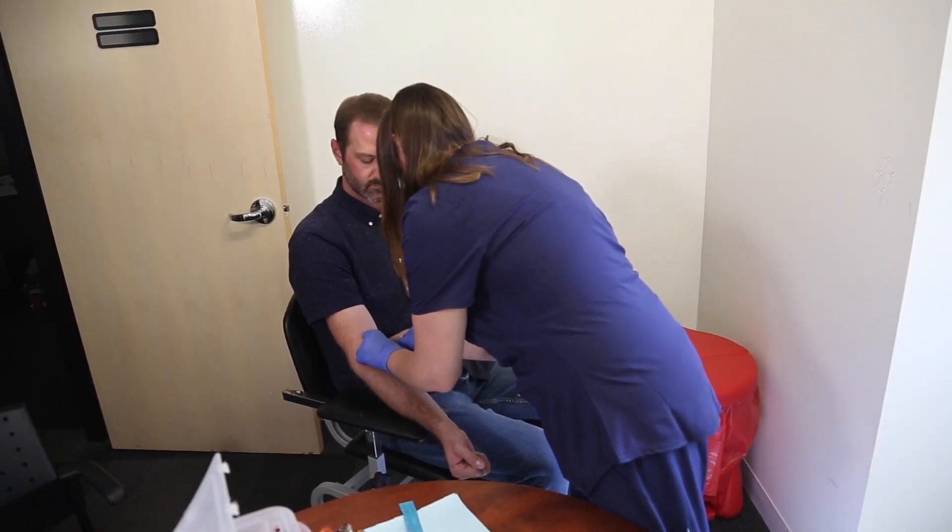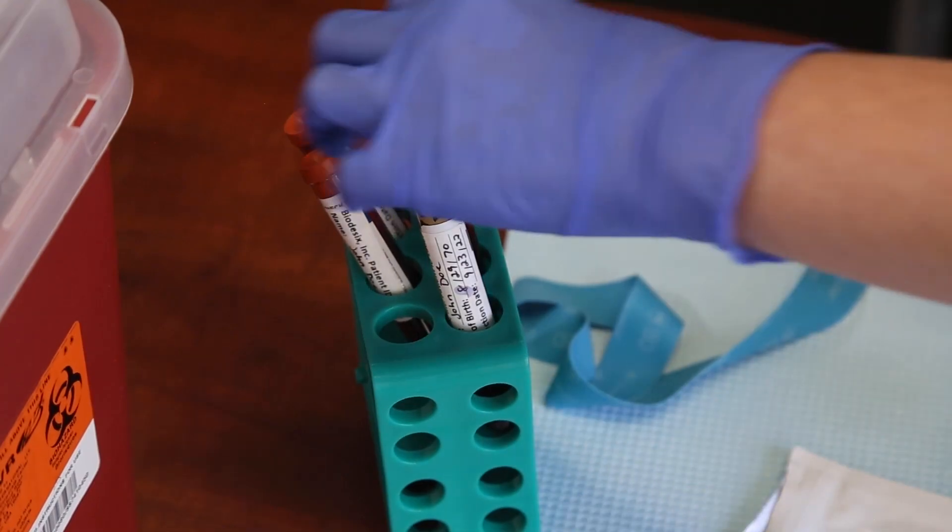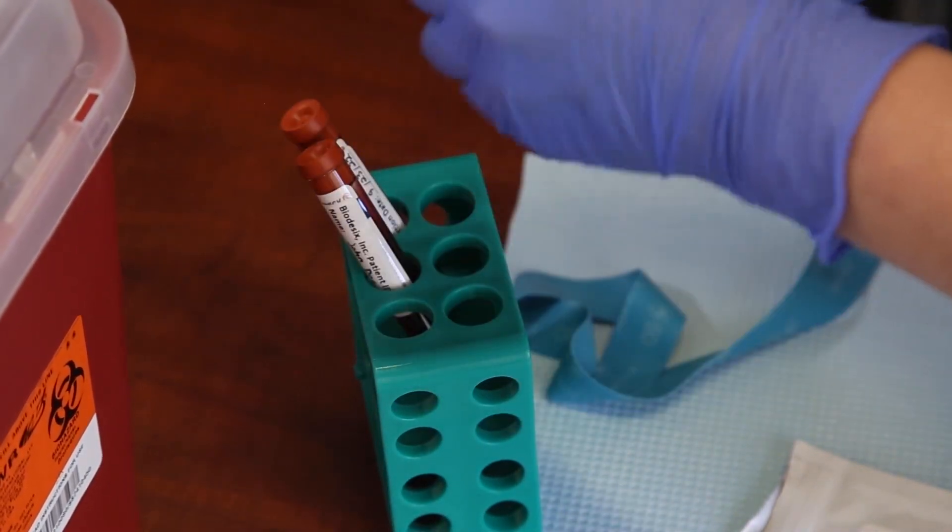After the draw, safely dispose of the needle. Then invert each tube 8 to 10 times to mix.